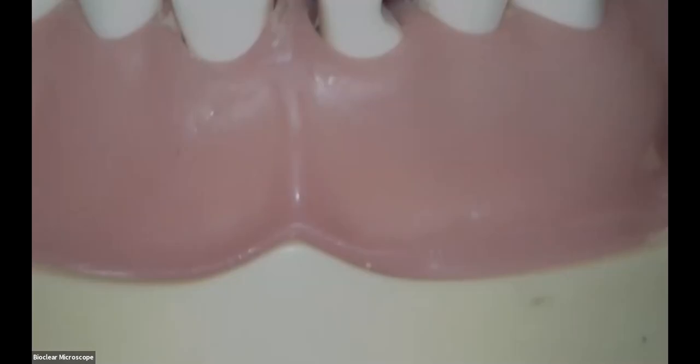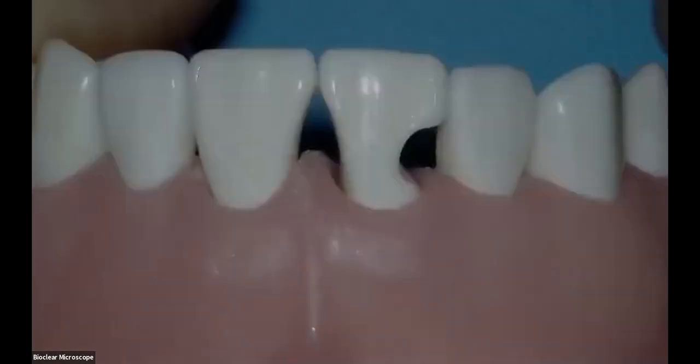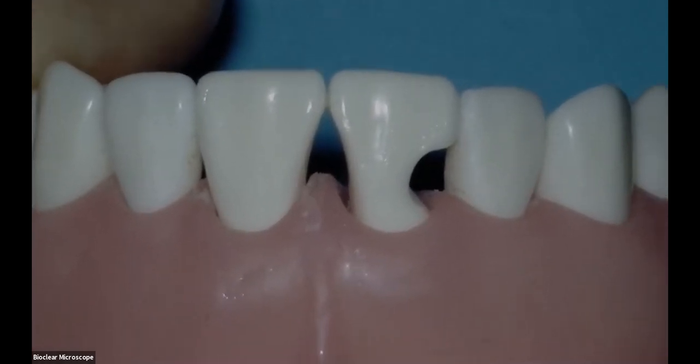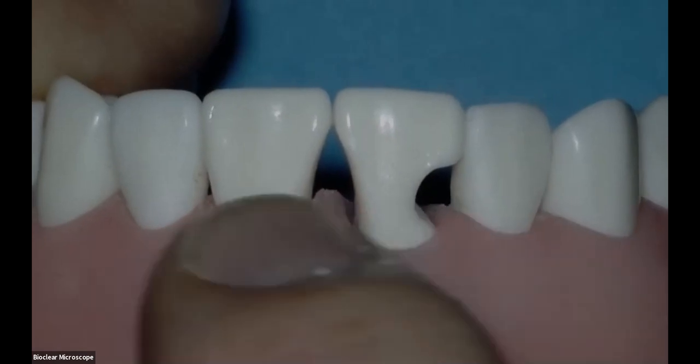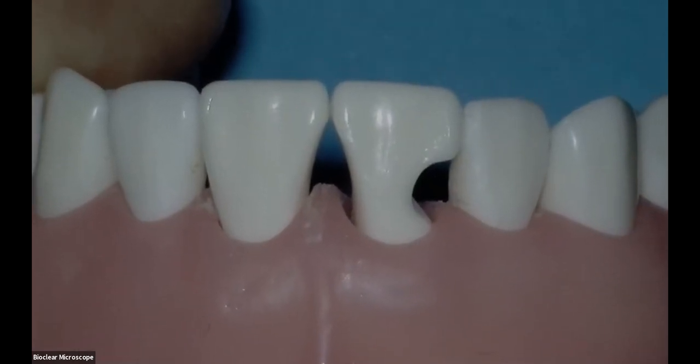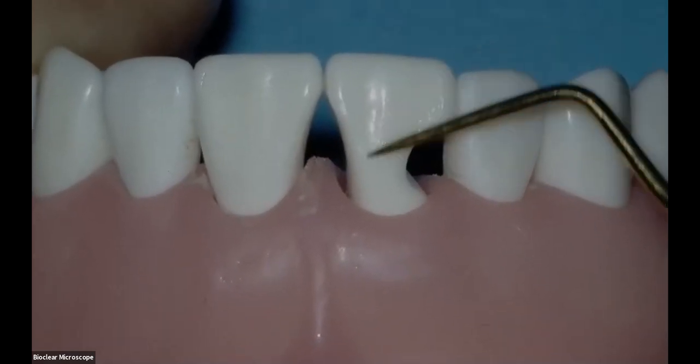So when we do a case like this, the first thing I'm going to do is think about, okay, what is next? What are the steps to appropriately treat a case like this? So what we're going to be doing is injection overmolding the 2 central incisors. And with Bioclear, we typically do a little bit of additive dentistry.